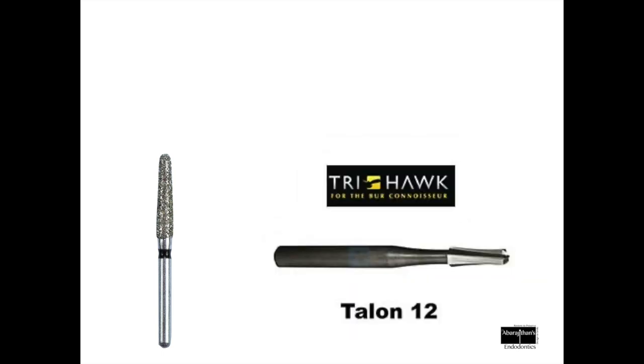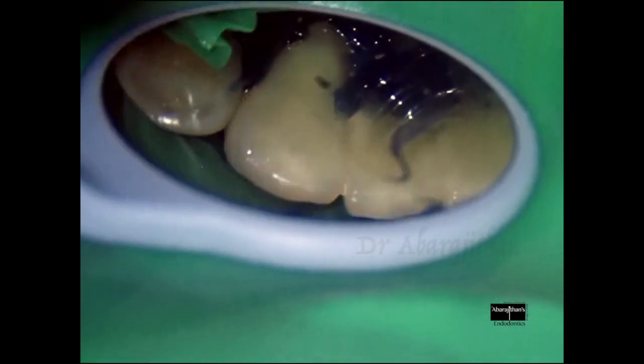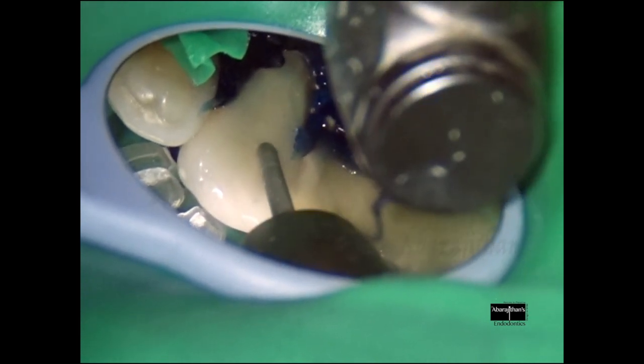Just like I showed in my previous video, here as well we are going to drill through the metal ceramic prosthesis, for which I will use my coarse diamond to drill through the ceramic part, following which I will use my metal cutting burr. This particular brand is my favorite metal cutting burr, which is Trihawk. The entire procedure is done under magnification and under rubber dam isolation.